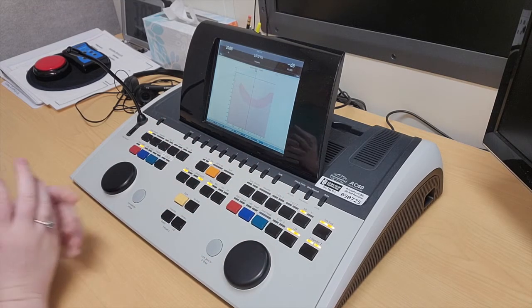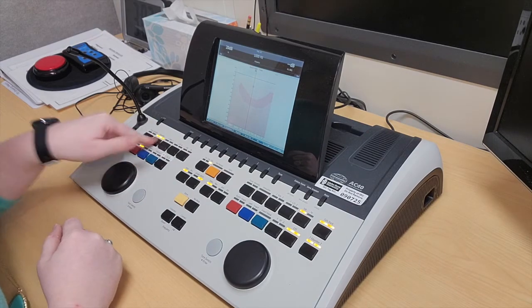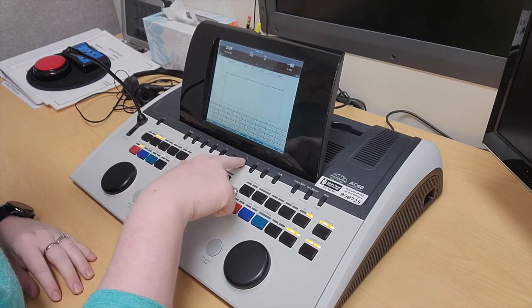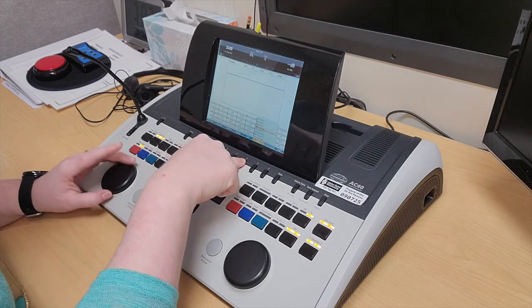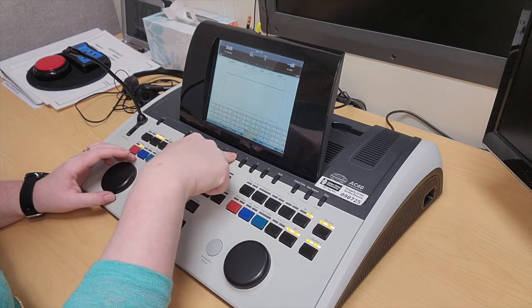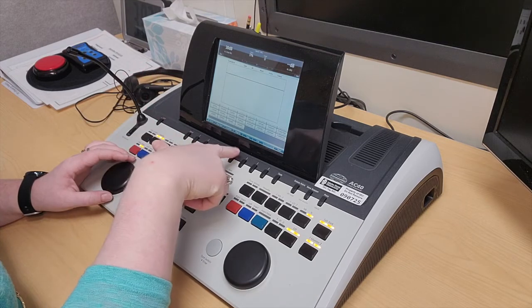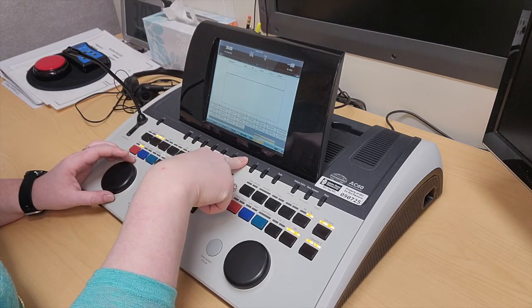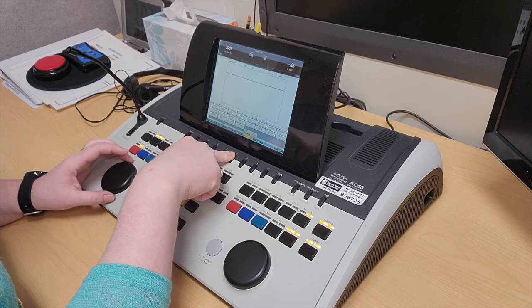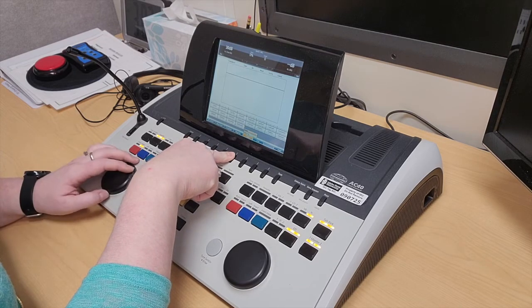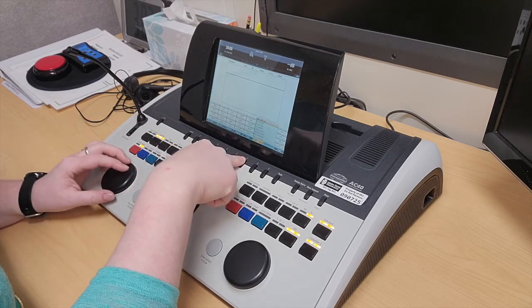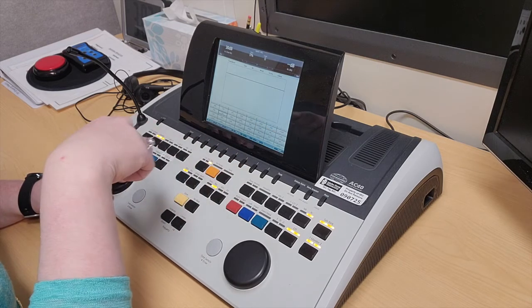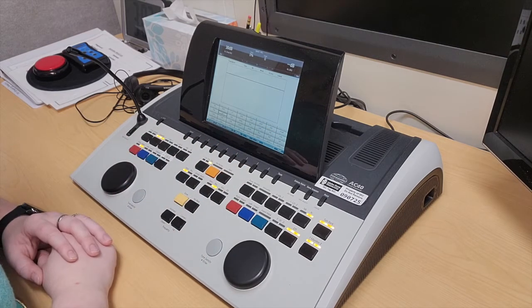For accessing the speech material, you would click WAV file and it pops up. You can click list and choose your lists, as well as clicking type to select what type of test you're doing. This is Phonetically Balanced A and B. Type was on multi-words, now I'm switching to just words. I can choose my list: 6A, 1A, 2A, 3A.